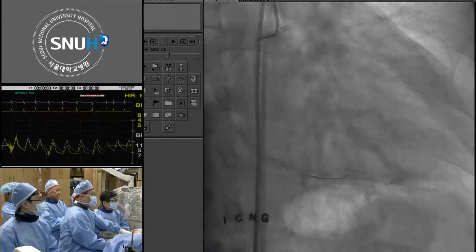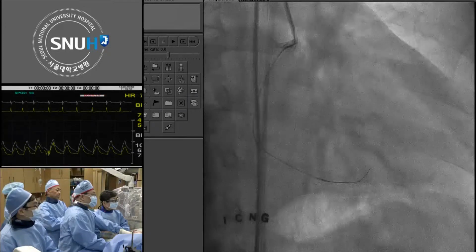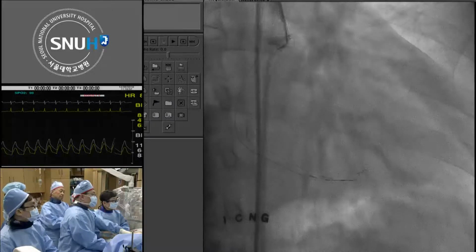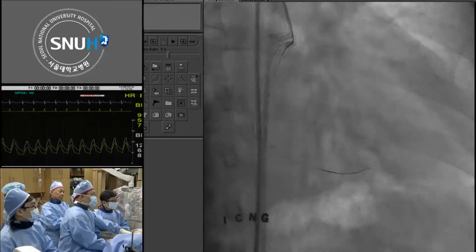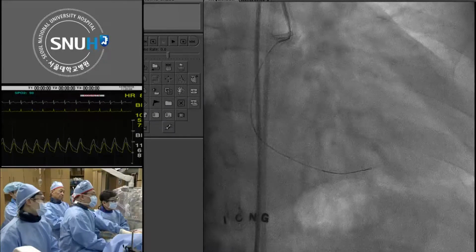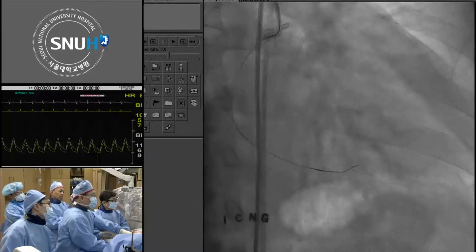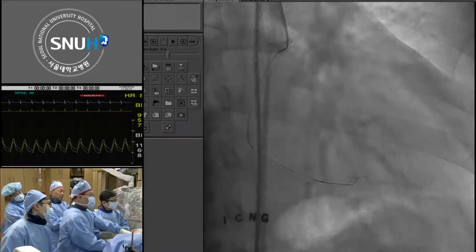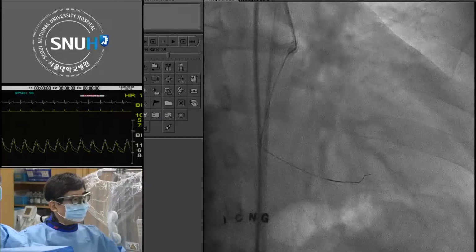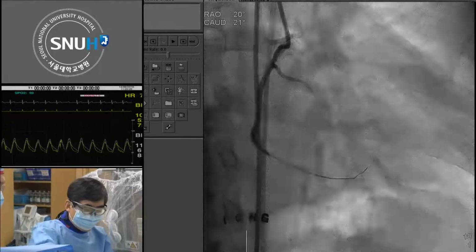Among panelists, which other guide wire would you recommend in this case? No, I think that for this stage it is the right wire. It's a beautiful wire. Later on it'll probably change, but right now it's fine. Would you think of another one? We all agree. It must be a wrong channel. Okay, I changed to XTR.